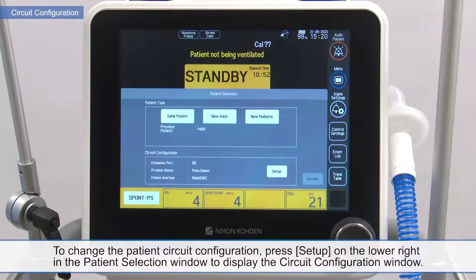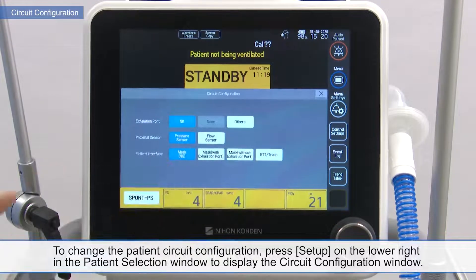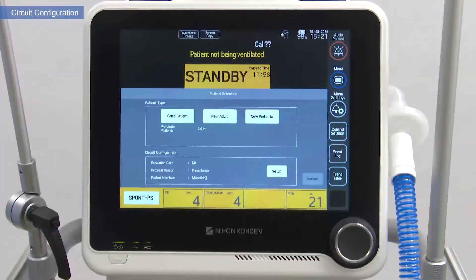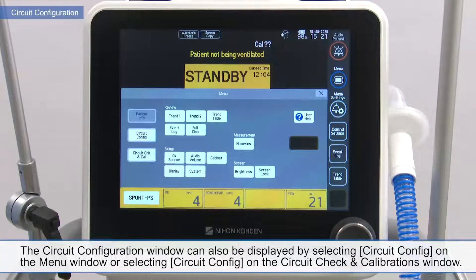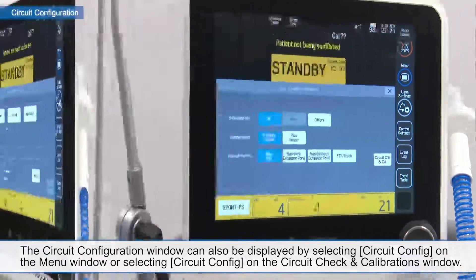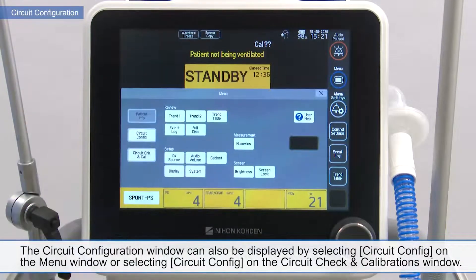To change the patient circuit configuration, press Setup on the lower right of the patient selection window to display the circuit configuration window. The selected items are displayed in light blue. The circuit configuration window can also be displayed by selecting circuit config on the menu window or selecting circuit config on the circuit check and calibrations window.